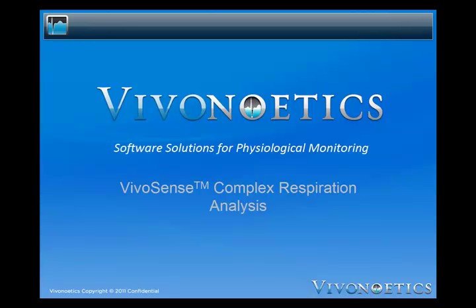Welcome to the VivoSense Complex Respiration Analysis Module video. The VivoSense Complex Respiration Analysis Software module includes analysis tools that enable a user to maximize the utility of respiratory measurements.